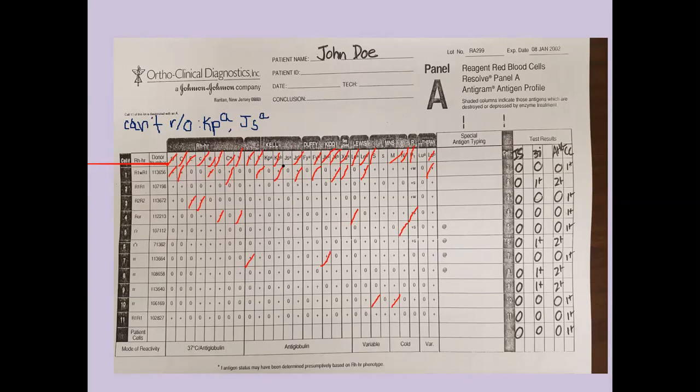Okay. So let's move on to Duffy A, and let's see what's going on here. Negative with a negative, positive, positive, 3 negatives. 1, 2, 3. 1, 2, 3. Get down here. Positive with a positive, negative with a negative, and then 2 positives, and 2 negatives. So I don't know what you think, but I think that's a pattern match.